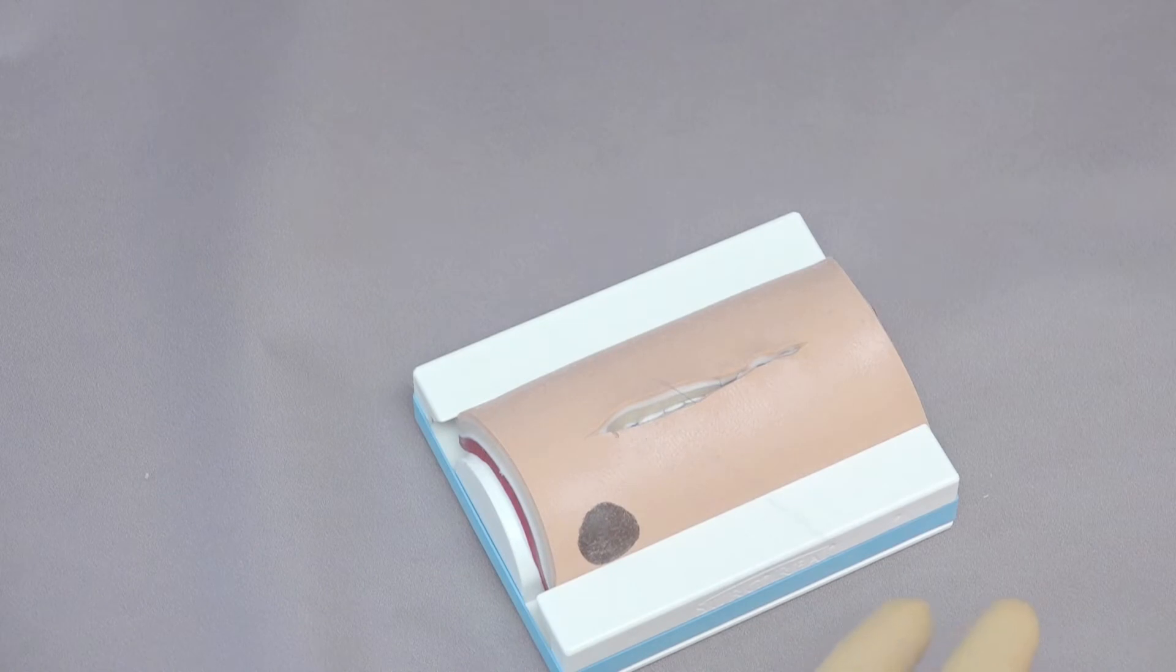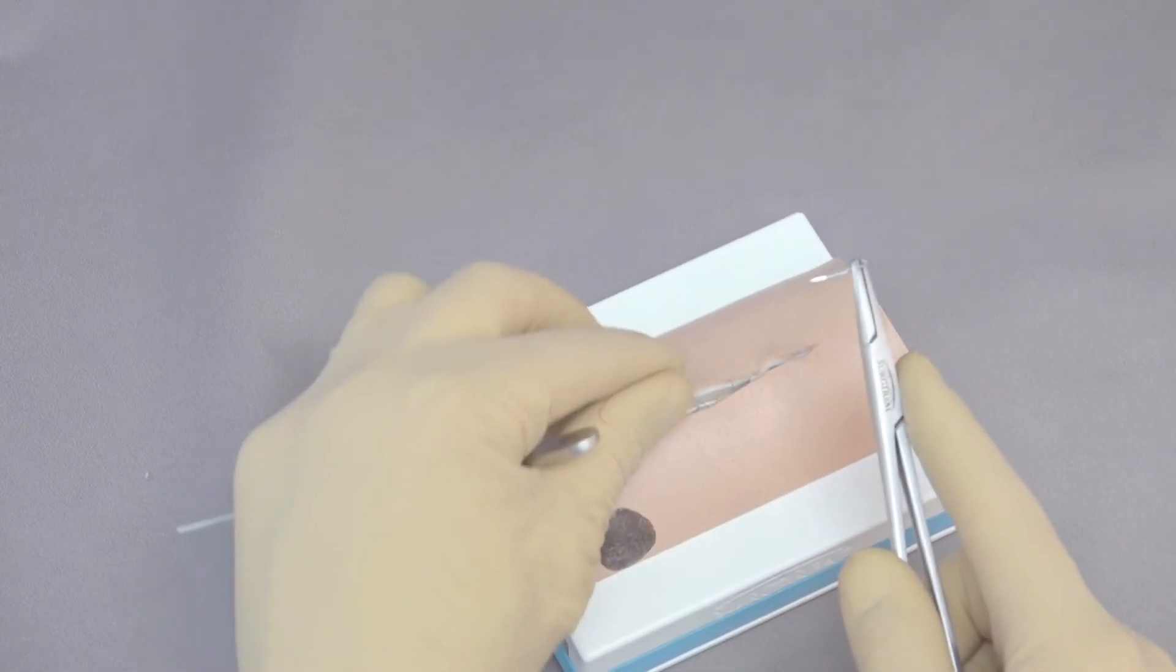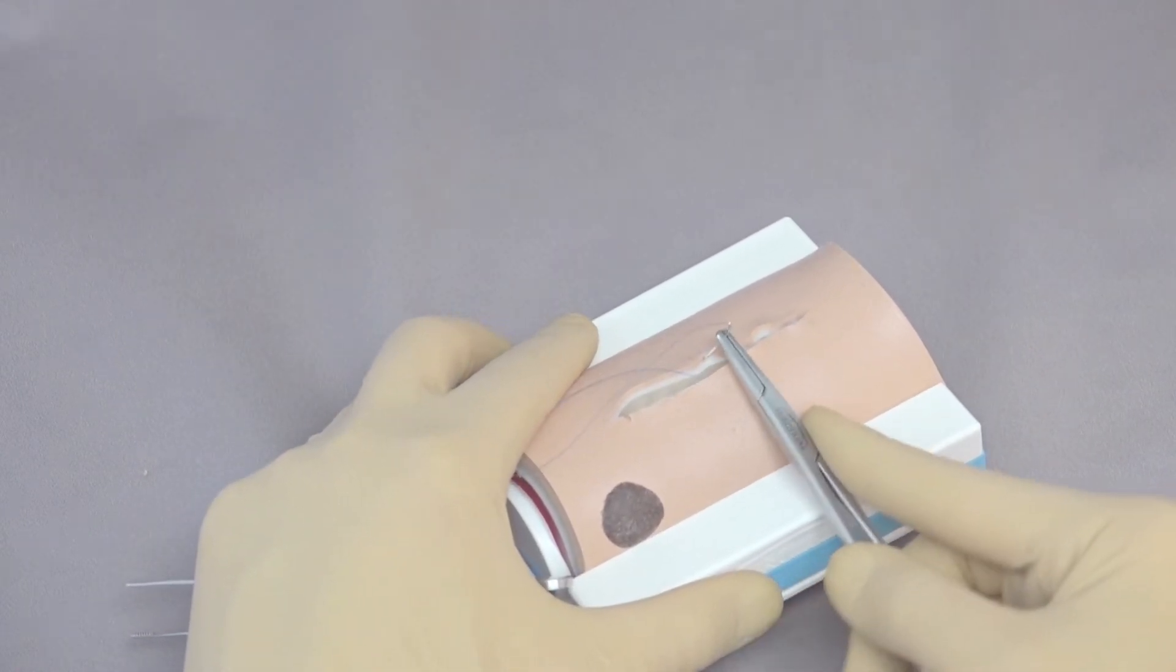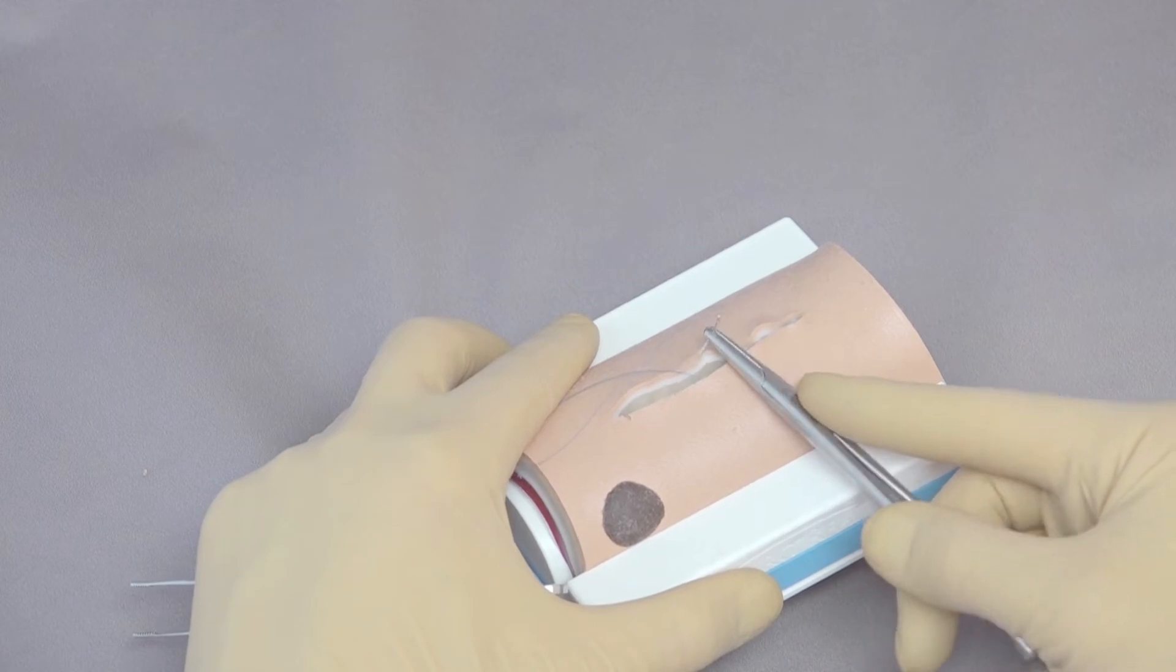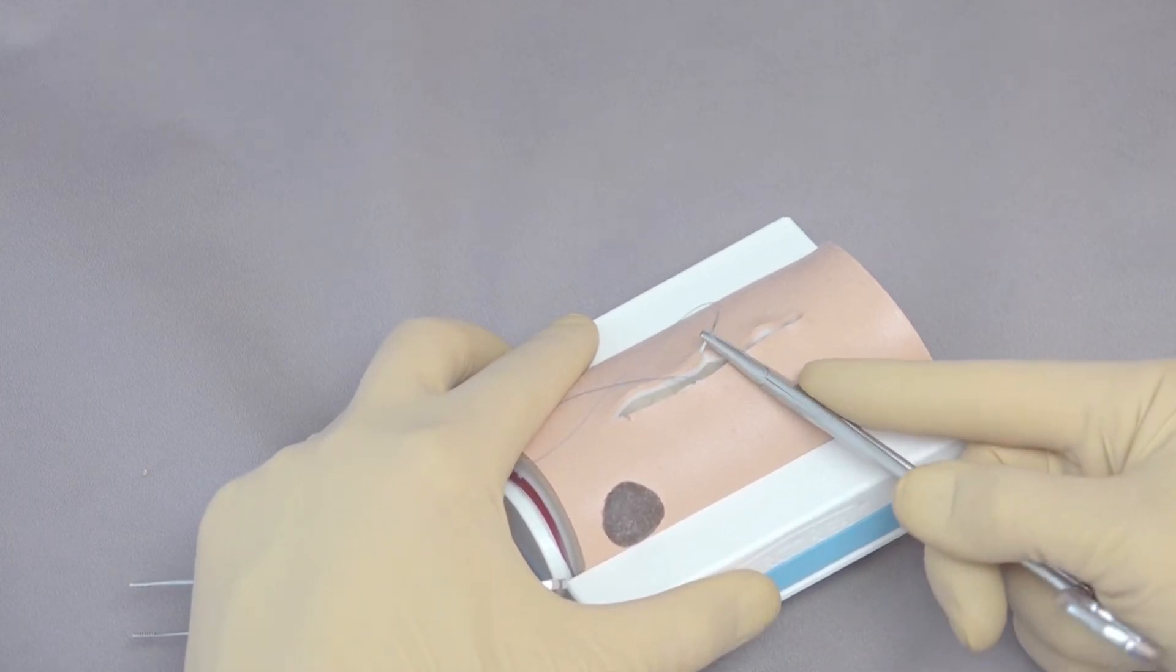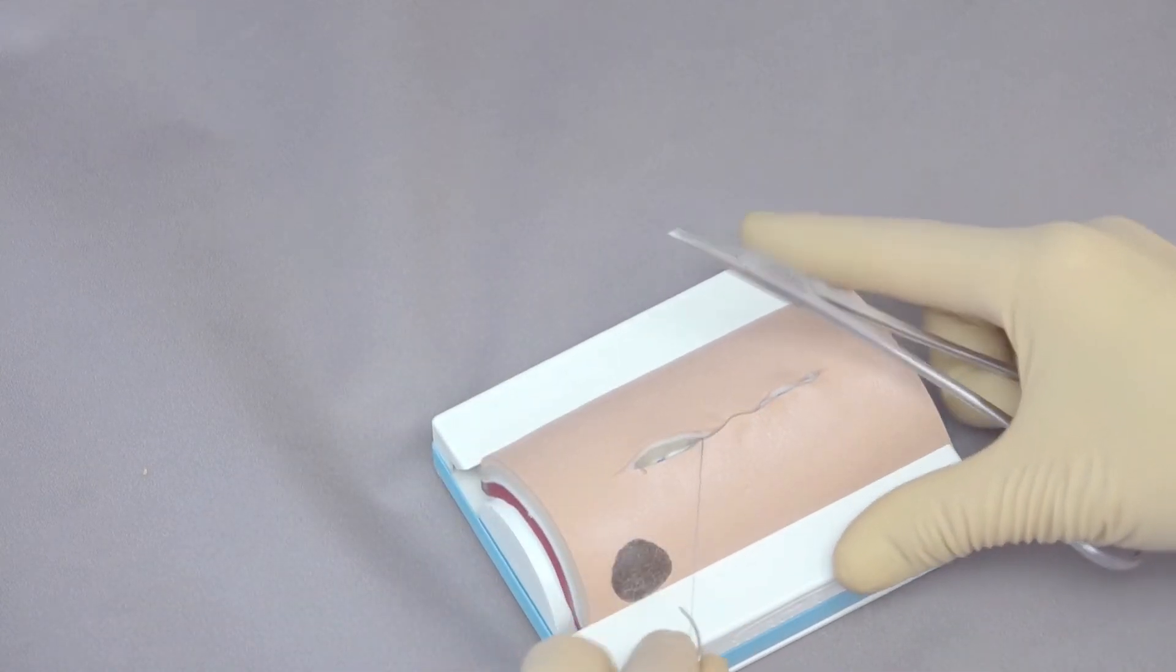And that's a part of this model that's really nice, is that not only does it teach you because it shows you where it's not coming together well, but it also is nice because if I don't like this and I'm unhappy with this closure, as I'll show you in a minute, you can just take it out and start again. You can do that multiple times. And that's the benefit of being able to do this in practice.